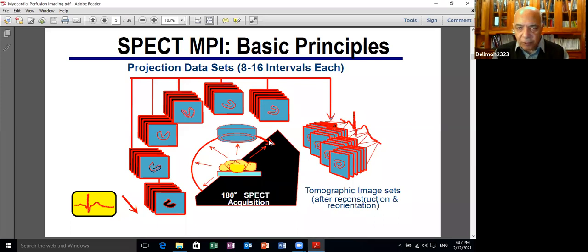So it's a projection from the material that has been obtained through the cardiac cycle over several hundred cycles of the heart rhythm, and then it's projected where it's formed into a four-dimensional structure. Then it is sliced in the way we see it usually in the reports of the nuclear imaging.